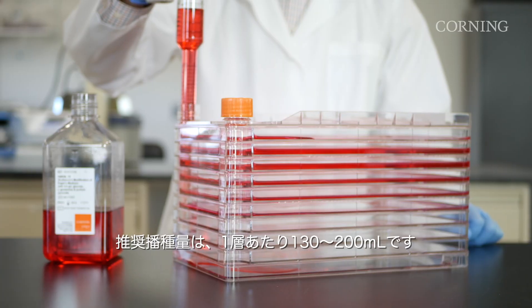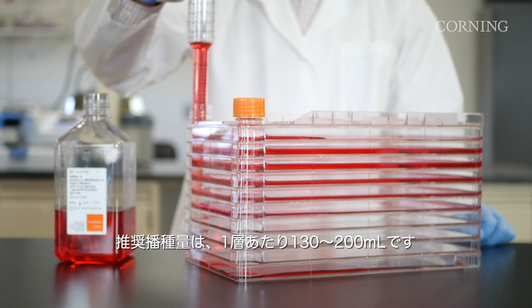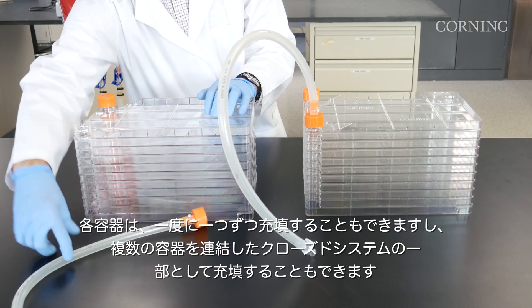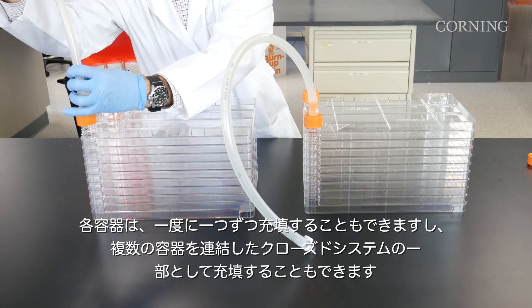The recommended seeding volumes range from 130 to 200 milliliters per layer. Each vessel can be filled one at a time or as part of a closed system of several vessels manifolded together.